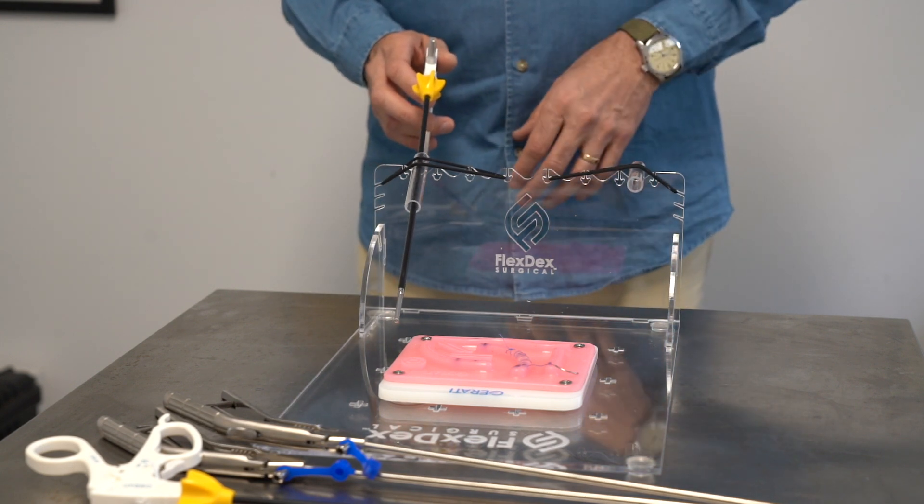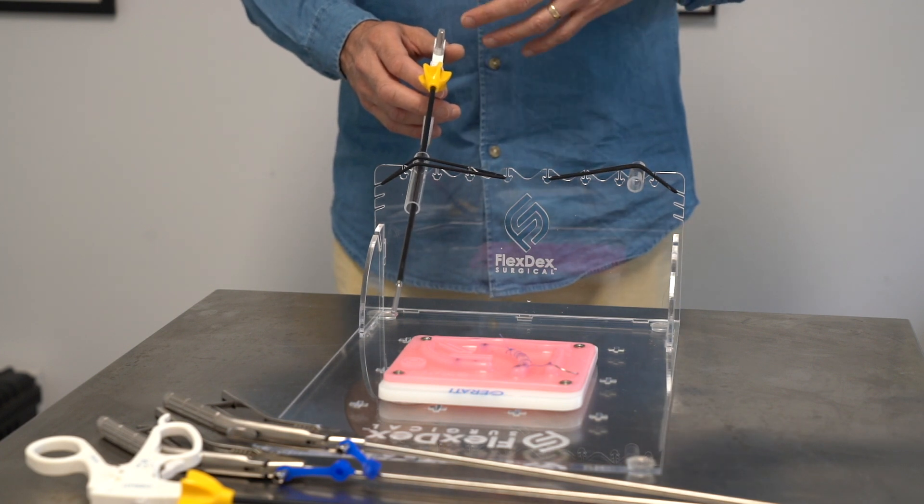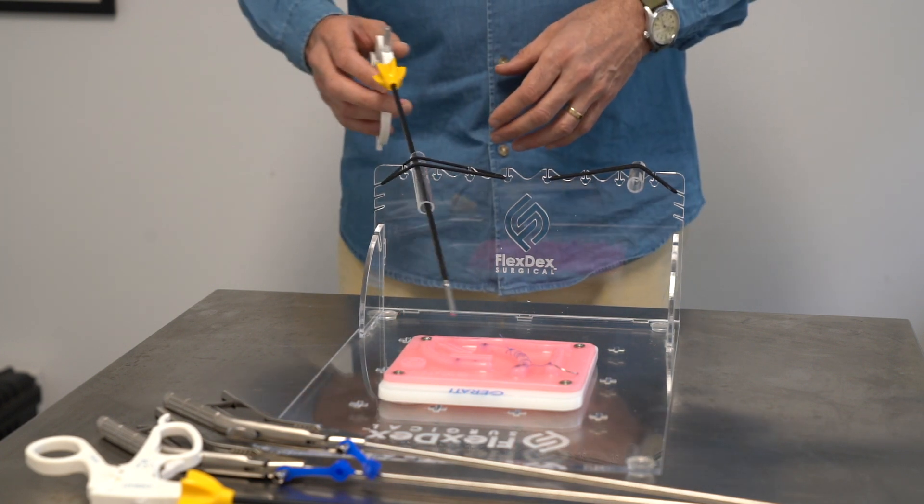It's the same with laparoscopic surgery. Because there's a fulcrum at the body wall, you have to learn to reverse your movements on the outside of the abdomen.